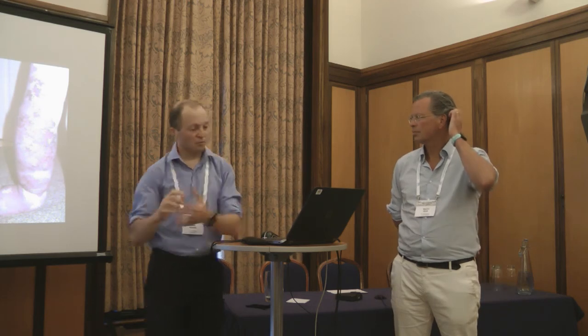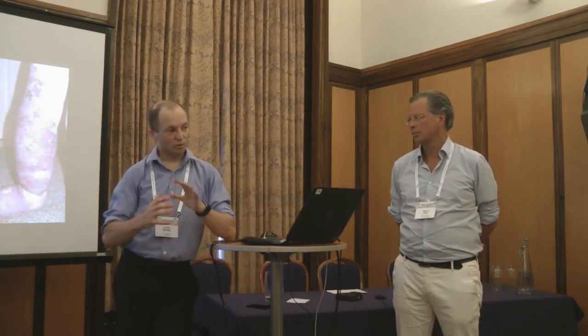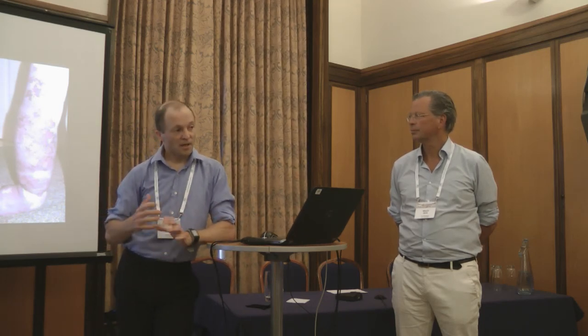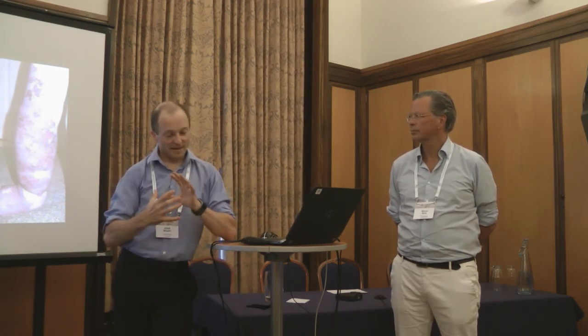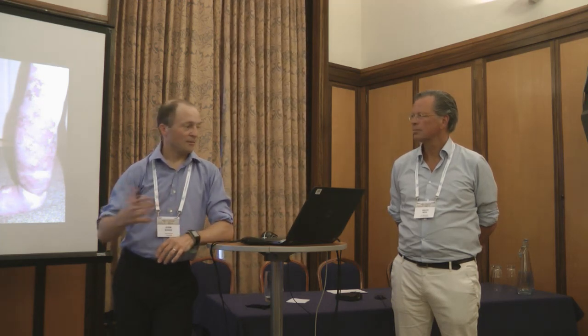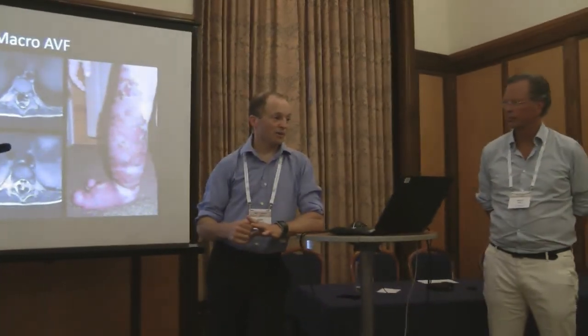Because once you coil that sac off, that sac does swell slightly. The cord's already compromised, not in this boy, but the one we did a couple of months ago. This cord is already compromised, and that little bit of swelling, which you can't detect from MR, causes them to deteriorate in 2 or 3 days' time, and that's when a combined approach would be really useful, to operate at the same time, and even just to do a decompression laminectomy.